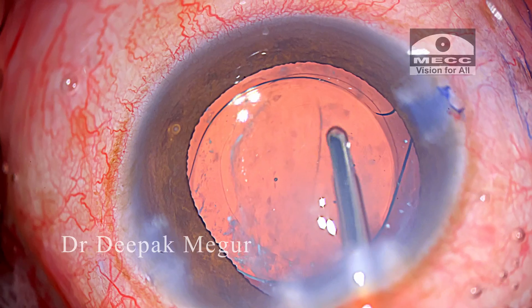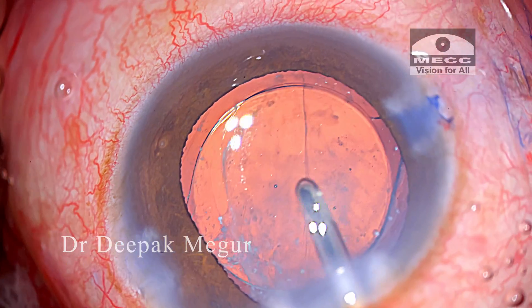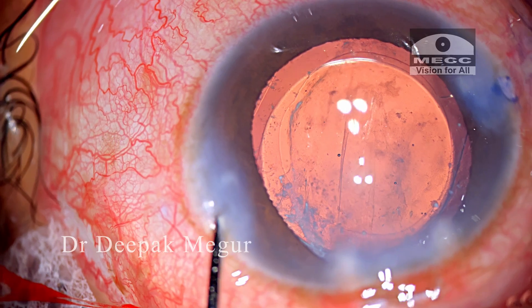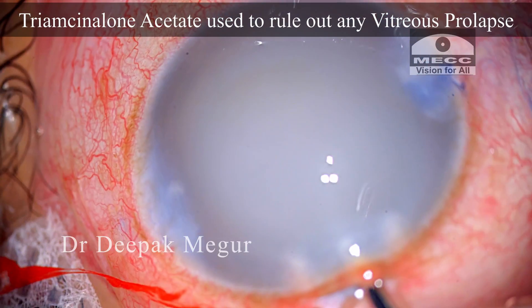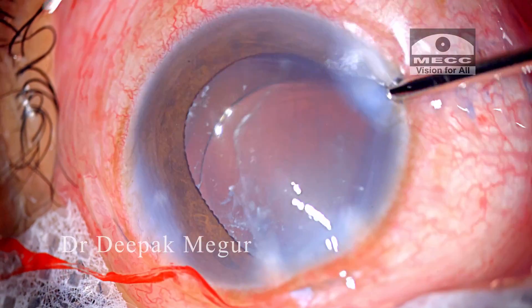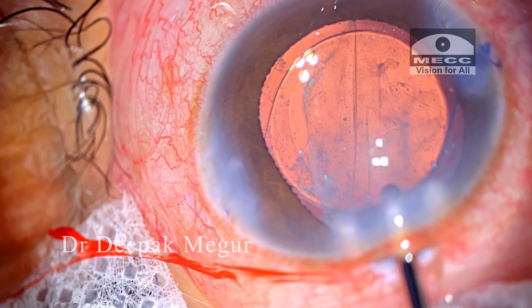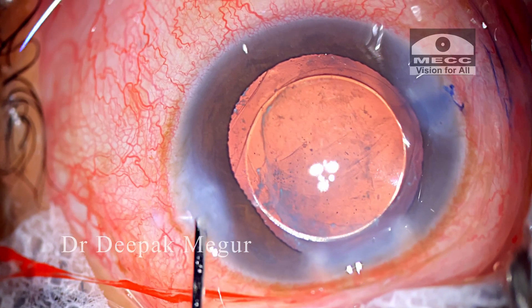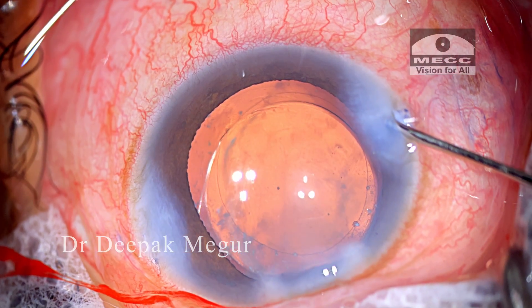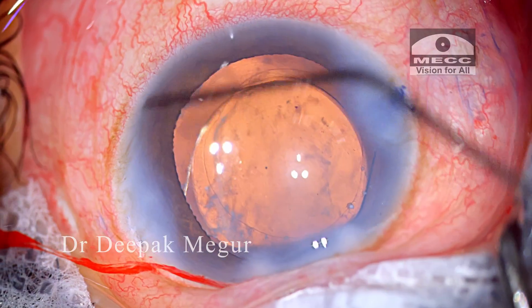The rhexis is slightly eccentric compared to what I would have liked. At hindsight, I think I should have put a CTR into the bag at this stage to provide some equatorial stability to it. During surgery at that moment, I thought the bag was too thin and flimsy for a CTR and was worried about causing trauma to the posterior capsule. But in hindsight, I think it would have been better to have used the CTR.